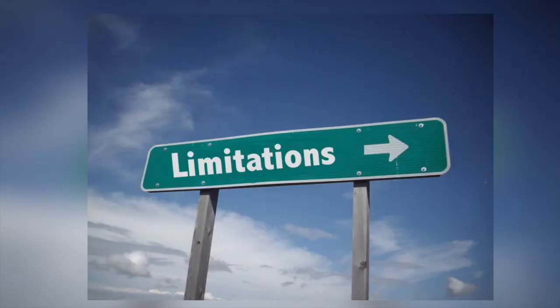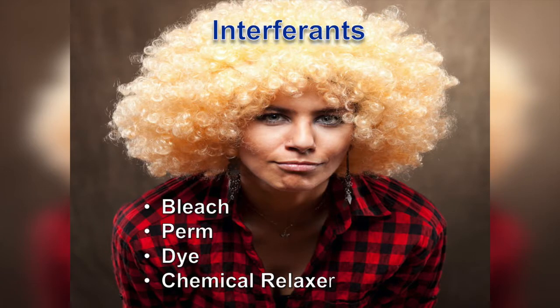And just like any other specimen type that we encounter in the laboratory, hair has limitations. And we need to appreciate those limitations when we're trying to interpret the results for our clients. First and foremost, bleaching, perming, dyeing, chemical straightening, or just cosmetic treatment. All of these processes contain varying amounts of either reducing or oxidizing agents. And depending on the drug, the hair color, the type of treatment, and extent of the treatment, it can affect the drug concentrations in the hair.